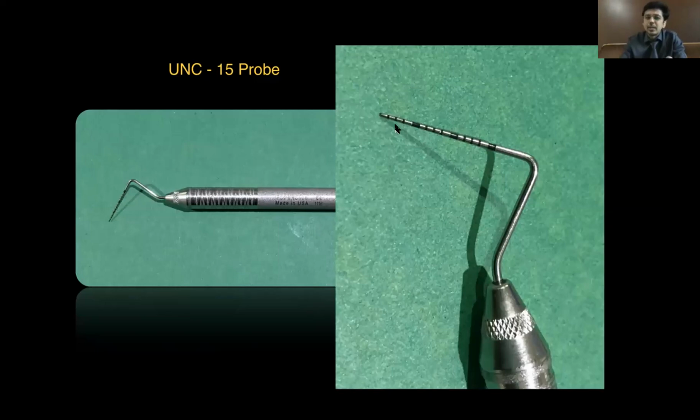It has black markings at 5 millimeter intervals. Straight away, you get to know whether you have gone to that adequate depth or not.